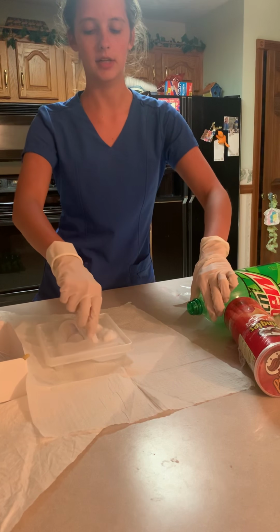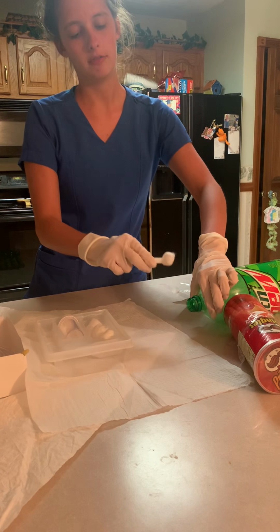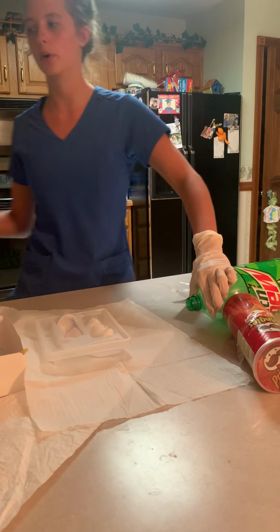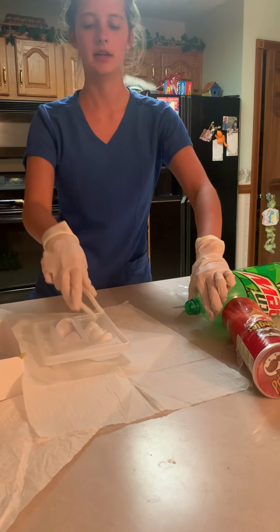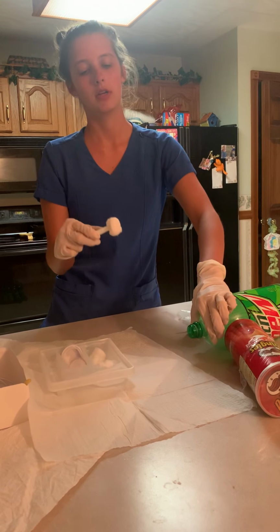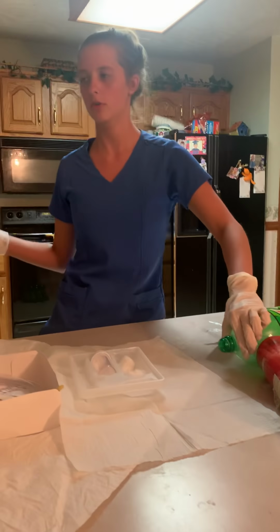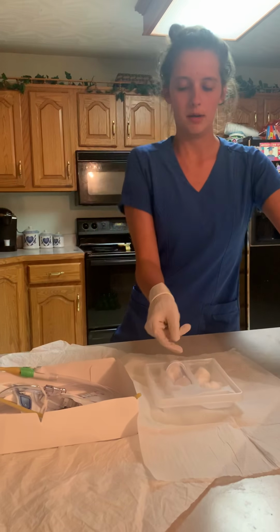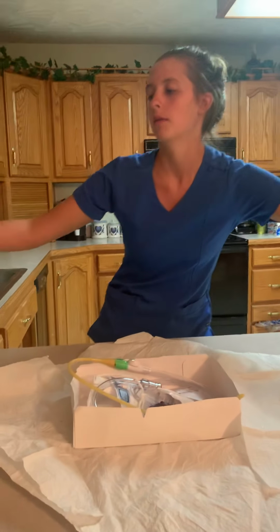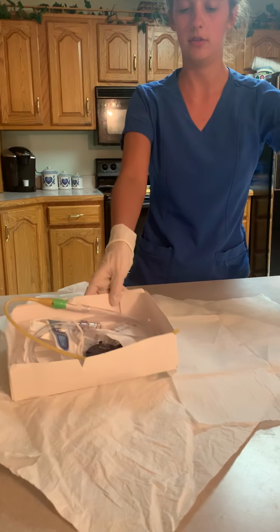We're then going to clean up above it just a little bit, around in a circular motion, out and away. And then if we need to remove any excess, we can go around and then out and away. And we no longer need these anymore, so we're going to go out and away. I'm just going to get my tray out of my way, and then position this a little bit closer.